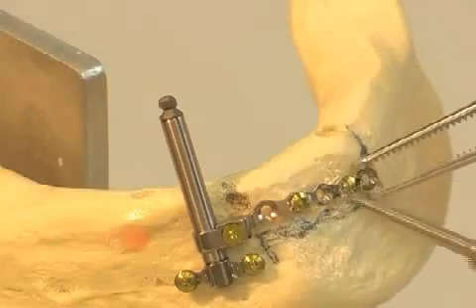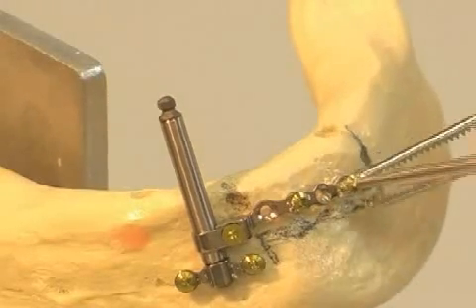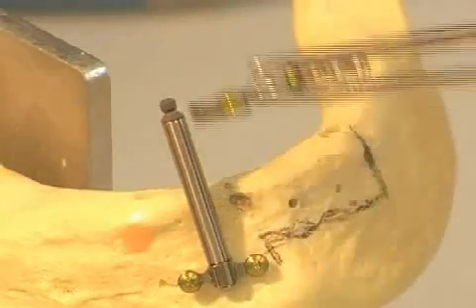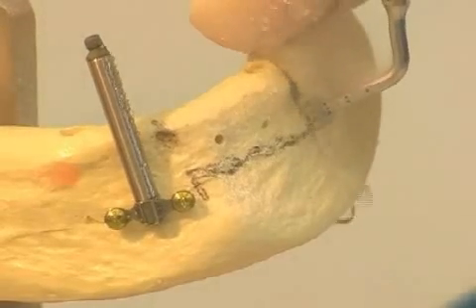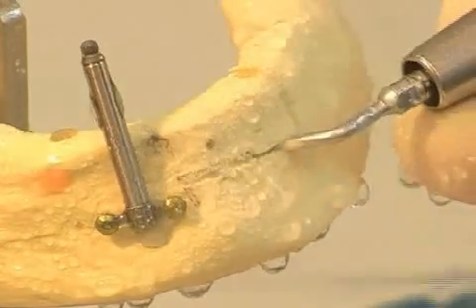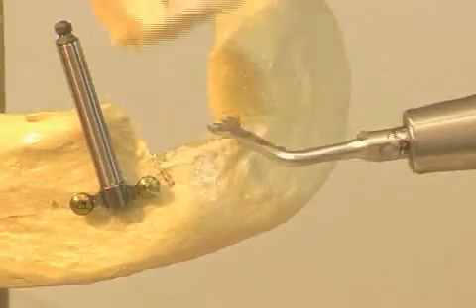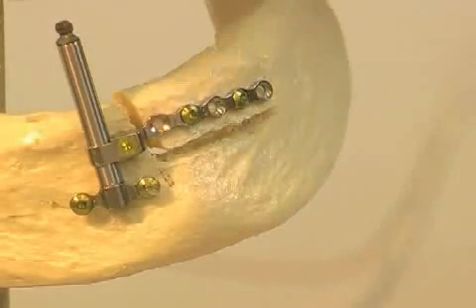After the pencil marking, special pens and marked drillings are also used in the actual mouth. Some parts of the distractor are taken out again; otherwise, it would not be possible to saw away the bone block from the jaw, as we see in this film. Following the mobilization of bone fragments, the distractor is assembled. By turning the winch, which later stands in the patient's mouth, the bone block can be moved effortlessly and painlessly.